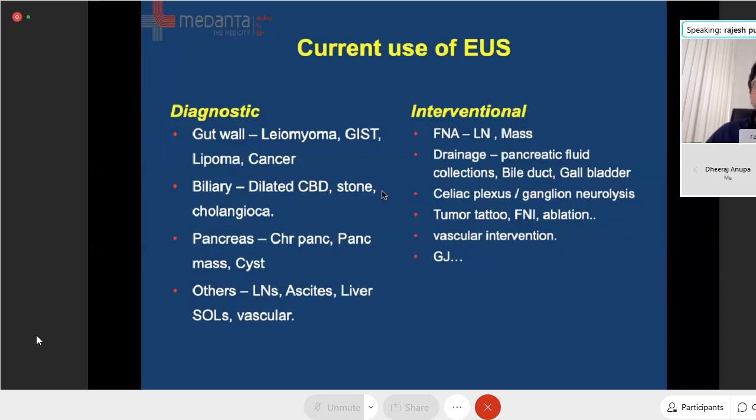The most important thing for the DNB student, which I want to highlight, because many times a referral comes with a mesenteric lymph node: you can only take FNA from periluminal structures, around the esophagus, around the stomach, around the duodenum, and around the rectum.